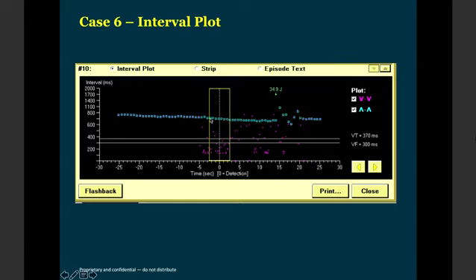Suddenly, what do you see here? The atrial rate continues to be slow. Suddenly you see very abnormal, unphysiological ventricular sensing happening all around the place. Whenever this kind of thing happens one day following the implant, it is likely to be something technical. It is unlikely to be a lead fracture. It can be a lead displacement, or it can be a loose connection between the lead and the device. You call it a loose set screw. So you should suspect that.